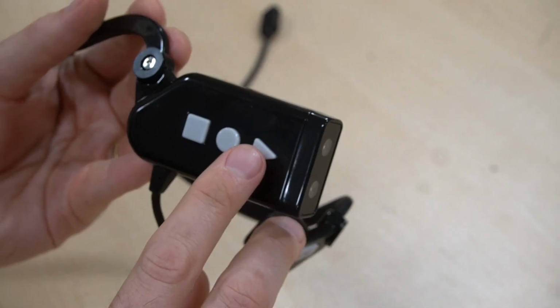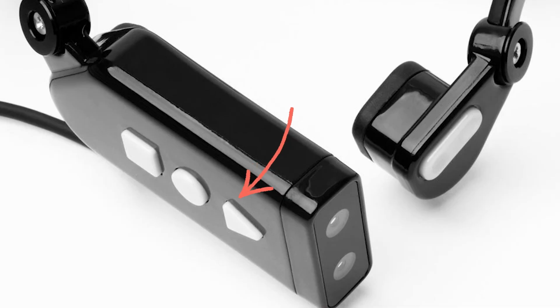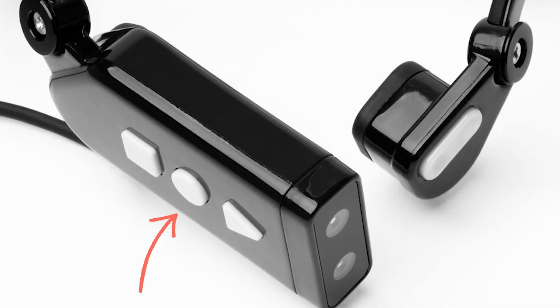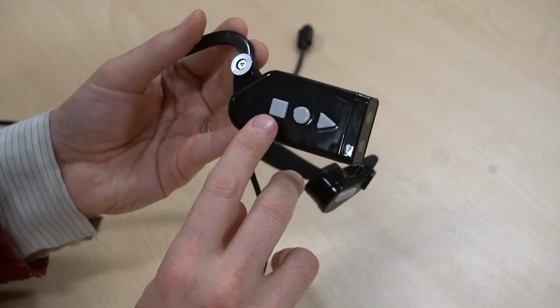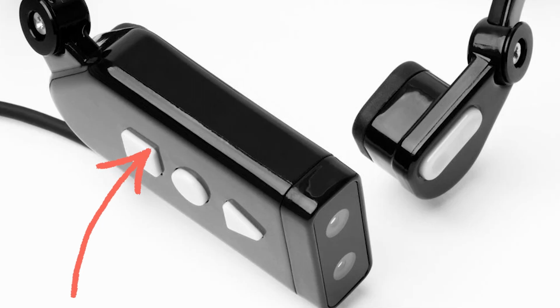In terms of the physical design, on the right side there's a rectangular area with 3 buttons. At the front there's a triangular button. This one will switch us between the different modes of the device. And next to that we have a circular button. This one will allow us to do voice control and also allows us in the object mode to switch between different objects that we're trying to locate. And then at the back we have a square button, and that one, if we hold it, will take us back to the idle mode, whereby the device won't be looking for anything, so it will be quiet.